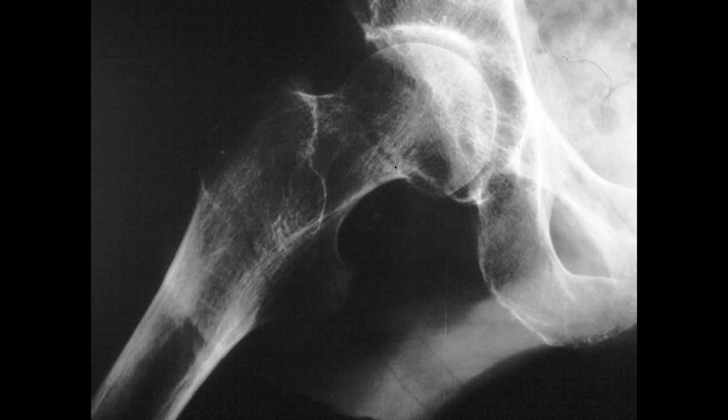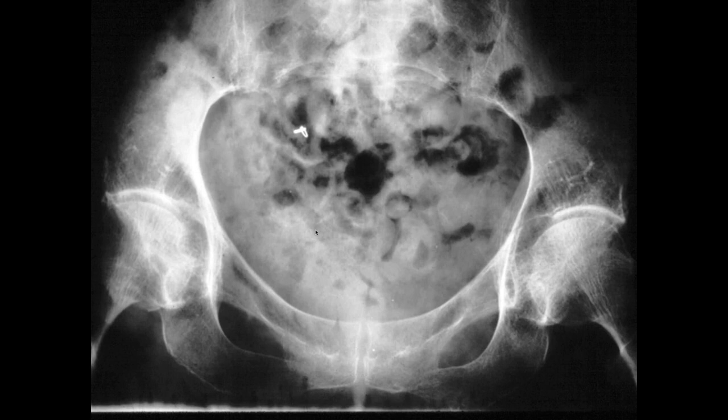This is a tomography, isn't it, John? No, I think this is just a frog-leg view. It looks like the old tomography. I used quite a few of them. Yeah, well, maybe the one before was an old tomography image. Yeah, that's what you can see, the trabeculae. But I think that's primarily because they have osteoporosis. Could we go back to that first image? Because I've never seen that. It's quite a contraption. It must be in a museum someplace where you can take a look at it.